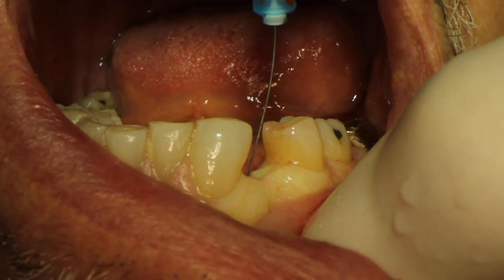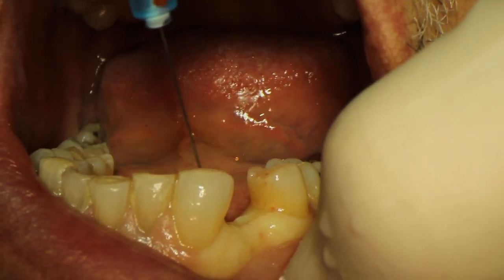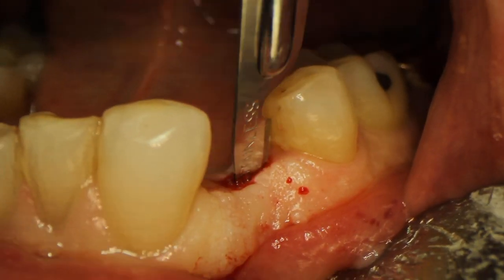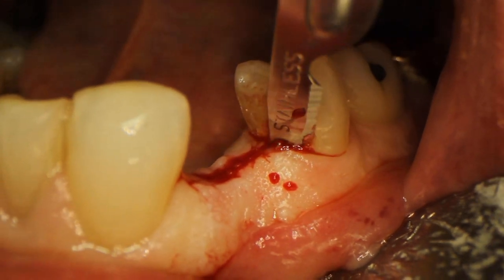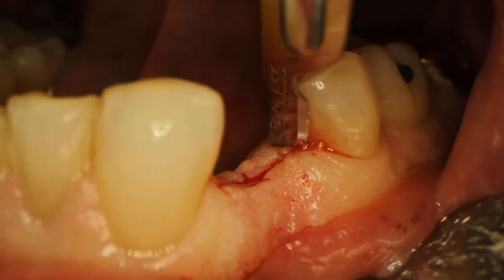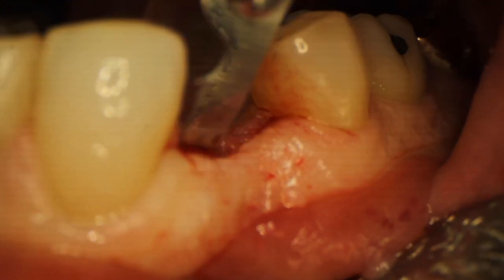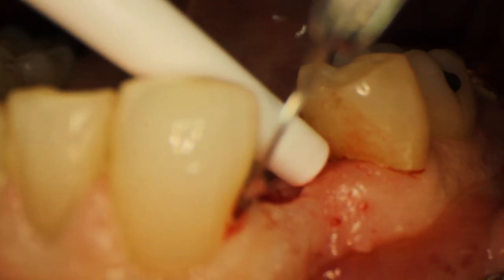I'm going to start off the case by giving local infiltrations with septicaine, going all around the tissue and making sure everything is nice and blanched — that means he's going to be good and numb. I go ahead and make my flap with a 15C blade, going along the crest of the ridge and releasing that tissue on the crest. Then I carry that into an intrasulcular incision, which means I'm going around the teeth — right around the sulcus of the teeth on the distal and the mesial — and I make sure to carry that a little bit lingual too. I go over it a couple of times in the same spots just to make sure the tissue is easy to release.